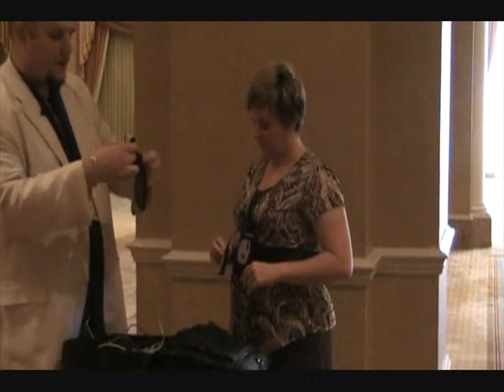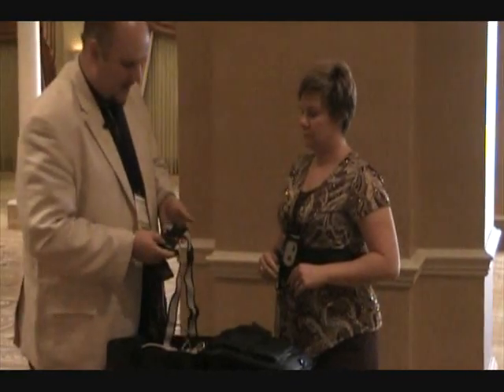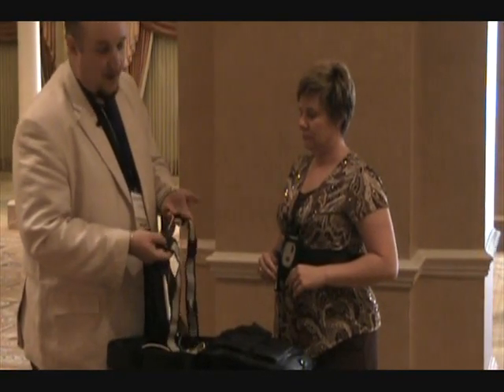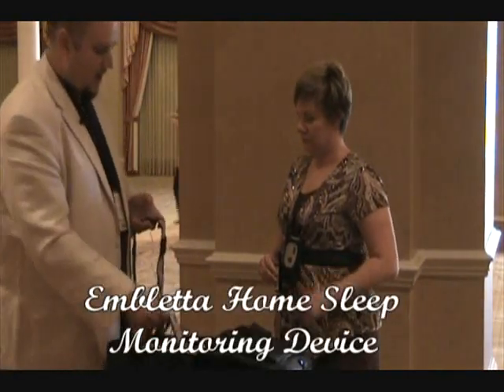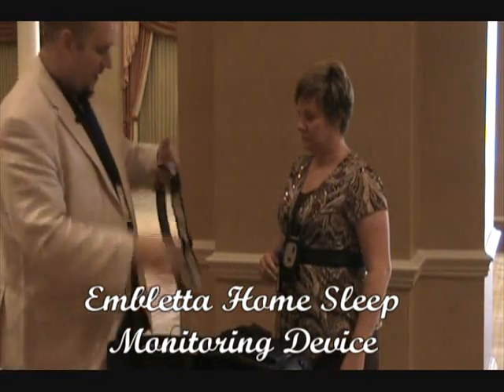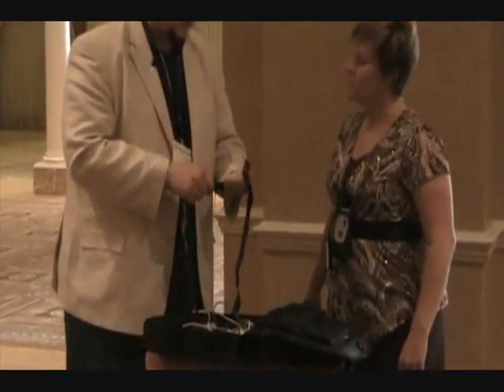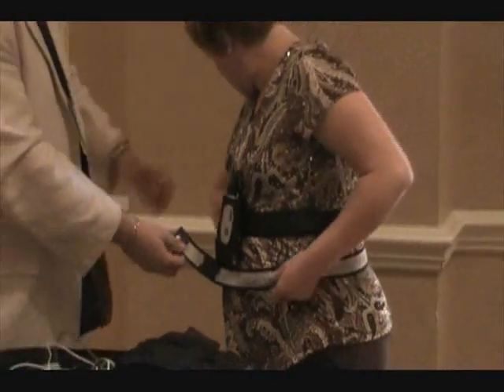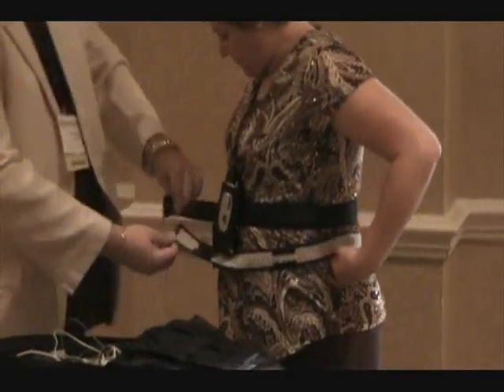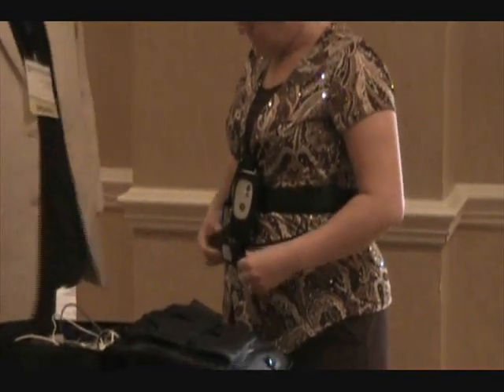We've got to hook up our two respiratory effort belts. You can see they're labeled — one is blue and one is yellow — labeled abdomen and thorax. One is going to go on your stomach around your belly button level and the other one goes under your armpits across your chest. Let's put the abdominal belt on first. With these clips, they just snap — you break them away and they snap together. Snap this one in place, pass it around, gray side facing out, then snap it on.